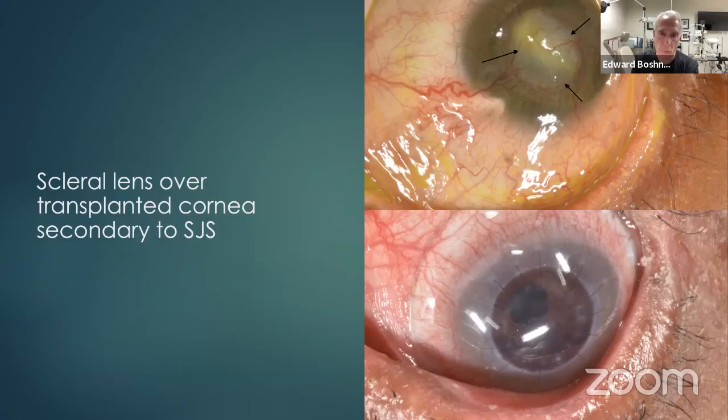That central area, this patient's from another country. That cornea perforated. The doctor used crazy glue to seal up the perforation. The patient came to Miami to have medical treatment done. We fit that eye with a scleral lens to protect it in anticipation for a surgical procedure that was to be done here in Miami.